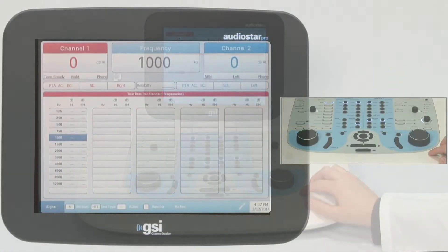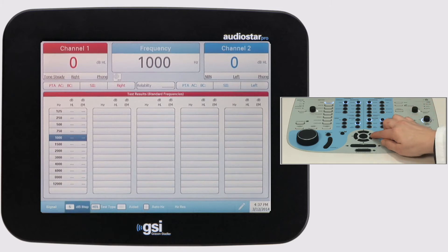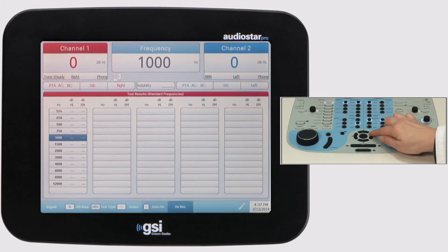A frequency table will appear with the standard test frequencies. Using the navigation panel or a mouse, select the high-res icon to display the frequency resolution options.